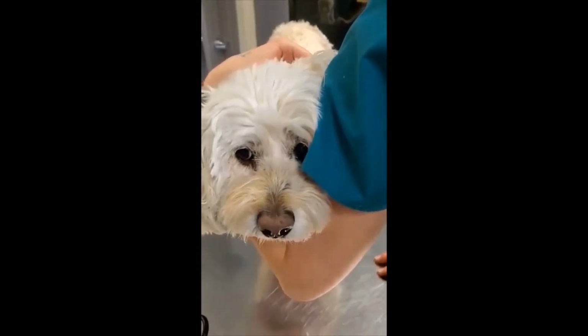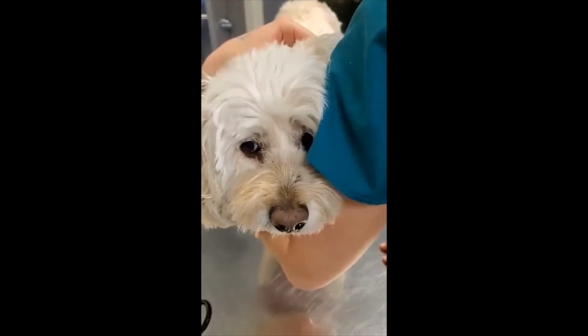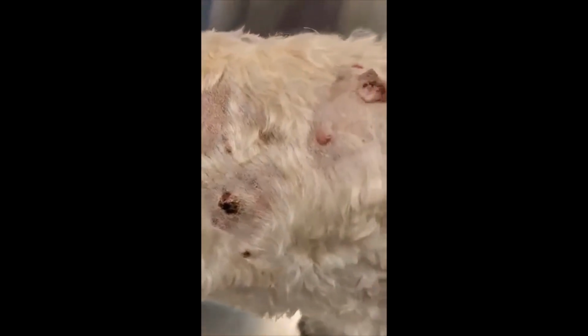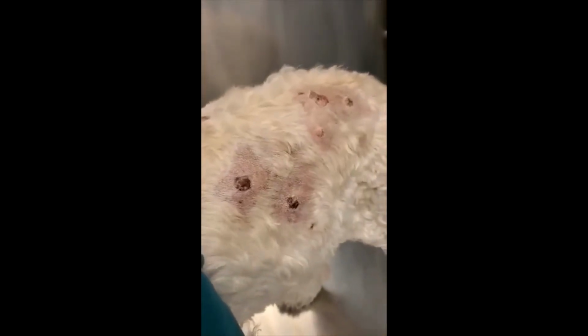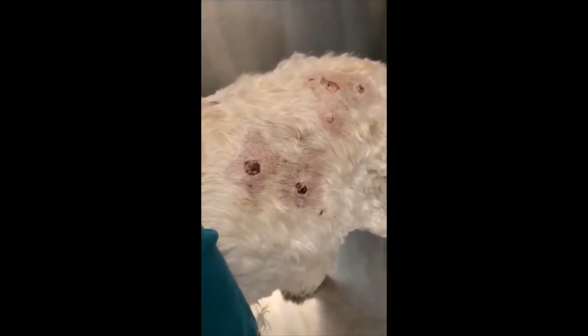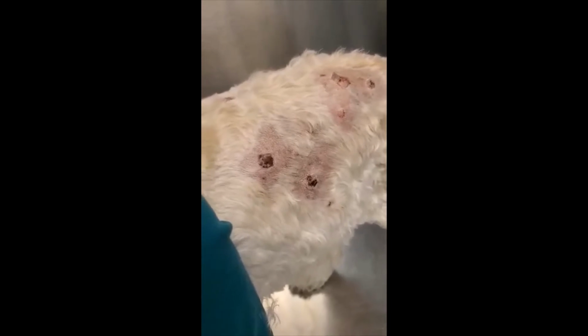Well, this is Roxy, a 12 plus or minus year old mixed breed Westie who was presented for multiple cutaneous papillomas. As you can see, they're quite extensive, and surgical removal would be both quite involved as well as create quite an expense. The owner has elected to cryo all of these papillomatous masses in an attempt to forego an extensive anesthetic procedure.